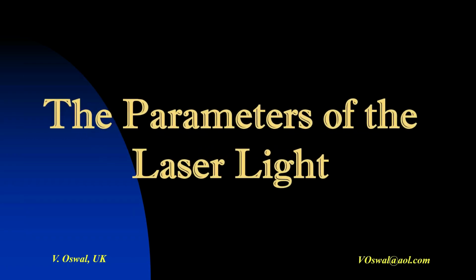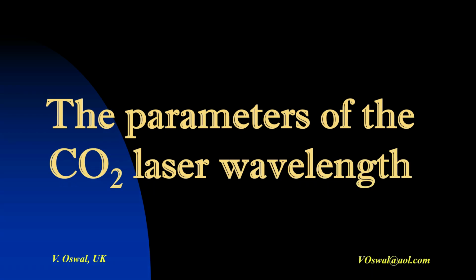Let's define some common terms used to express the various parameters of laser light. However, it's important to note that in isolation they mean very little in understanding the laser action on tissue. The eventual tissue effect depends on how a particular tissue interacts with the laser energy, as described later.